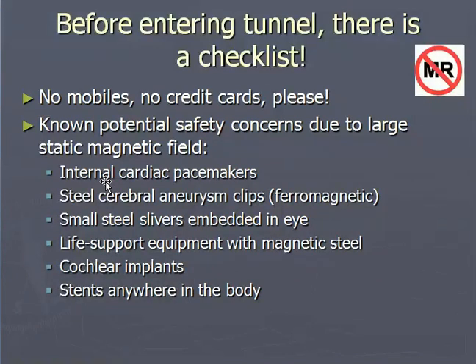He must have no mobile, no credit cards, no known potential safety concern due to the large static magnetic field: internal cardiac pacemakers, steel cerebral aneurysm clips, ferromagnetic small steel slivers embedded in the eye, life support equipment with magnetic steel, cochlear implants, stents anywhere in the body. If they are ferromagnetic, they will be pulled and a disaster may occur.